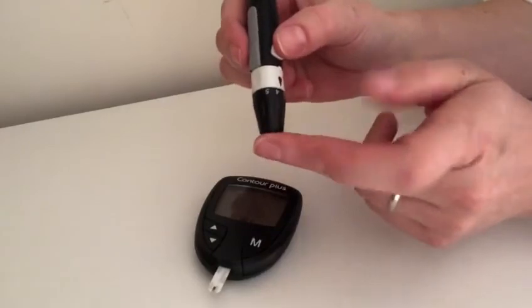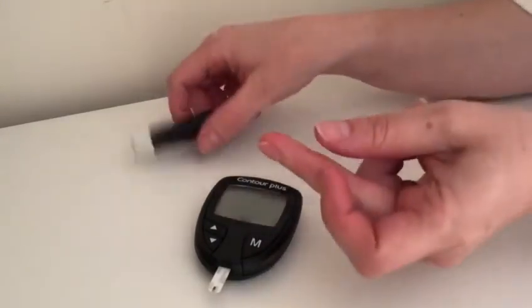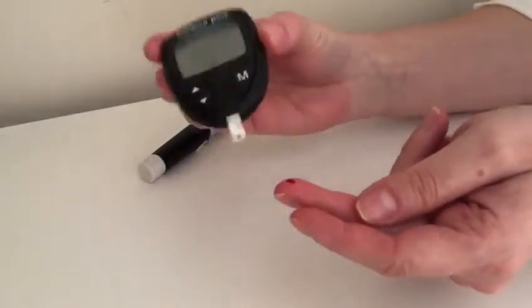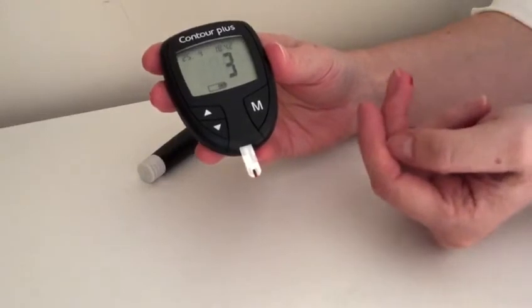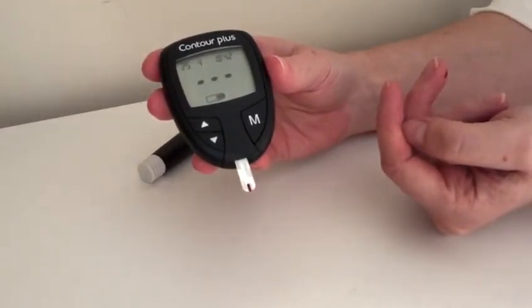To prick your finger, take the lancing device to your finger and press the white button in the middle of the lancing device. You may need to stroke your finger gently to get the blood to the surface of the skin. Make contact with the end of the testing strip to the blood and it will draw it up into the little window on the testing strip.